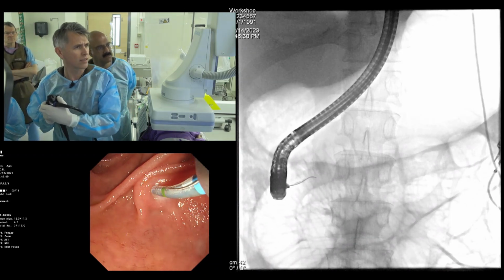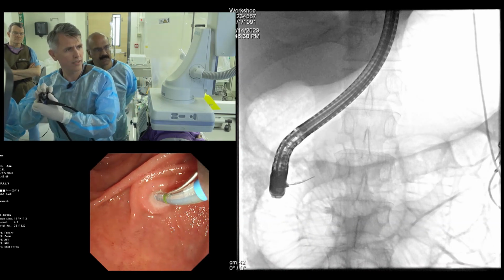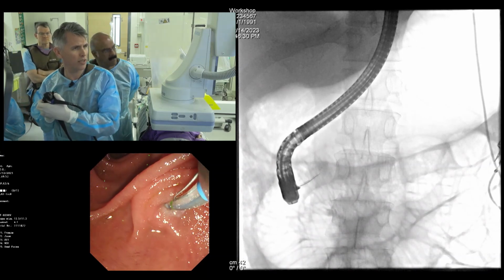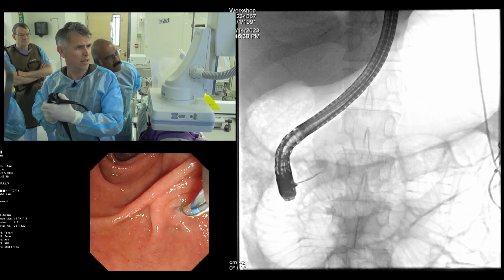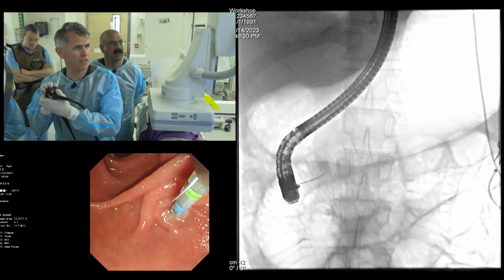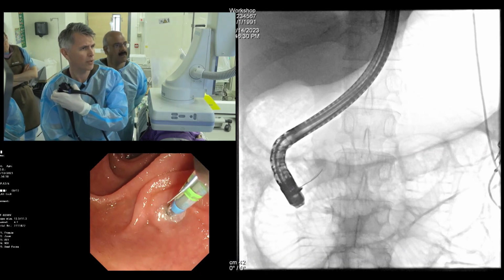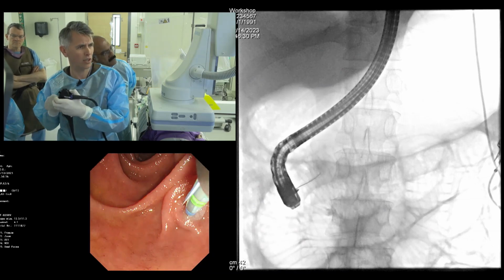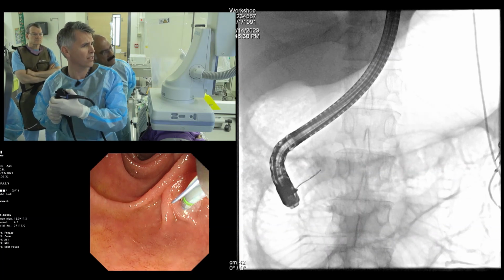It's a very nice demonstration by Torsten of how he's inserting the papillotome and then rotating the scope so that you can see very nicely. I push a little bit here forward. We can go into the pancreatic direction. Please try again to cannulate. We have some resistance here. So that's where the shadow maybe is, we're at the level of the stone. At this level, I push now the scope a little bit forward to get in the position from below. Maybe you can try again to cannulate with the wire, advance the wire. So I think we are at the level of the stone.